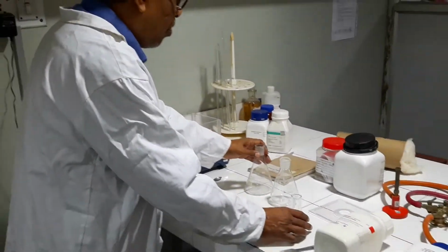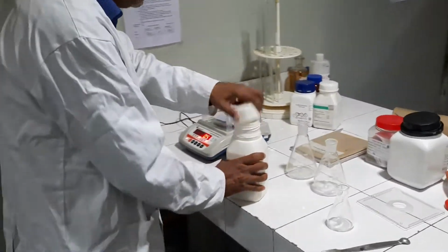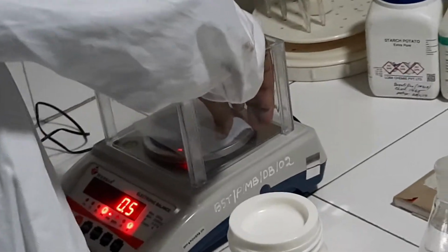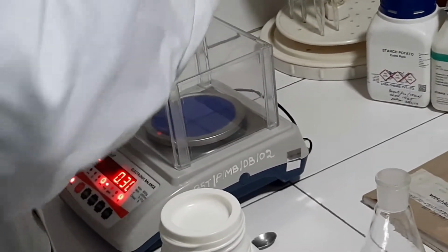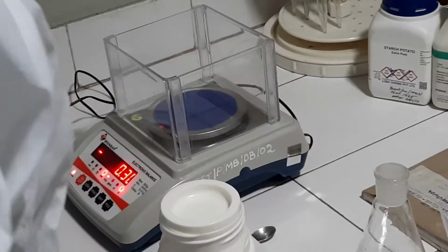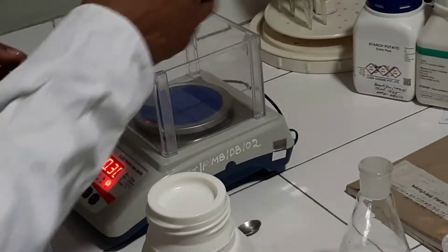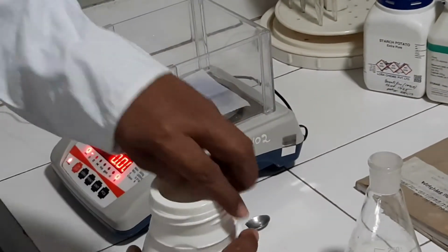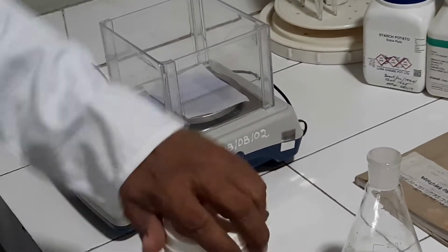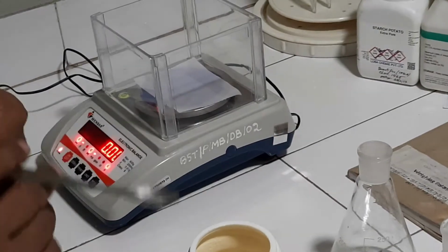The next item is beef extract, 500 milligram for 100 ml. We will use another spatula.